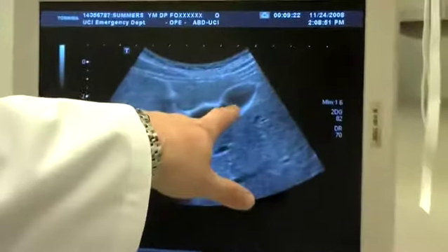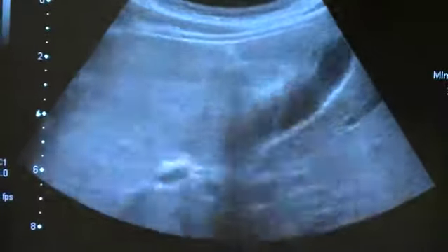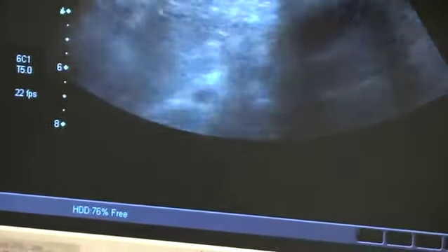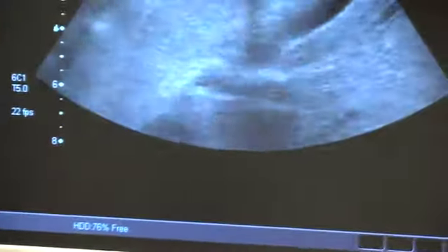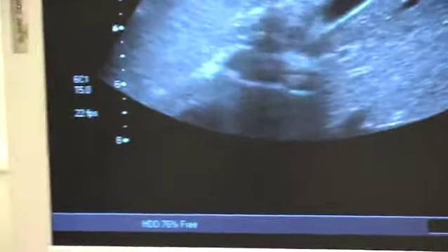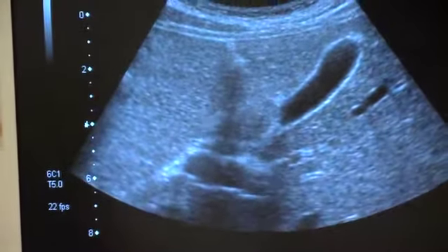This right here is a little fold in the neck of the gallbladder. Normal. Okay. You're doing great. You want to take a break on the deep breaths? Okay. Whenever you're ready, you're going to take another deep breath and hold it. Okay. Anytime in ultrasound, if you want to go from long axis to cross section, you just turn 90 degrees from where you're at. And now I've got a cross-sectional view of the gallbladder.